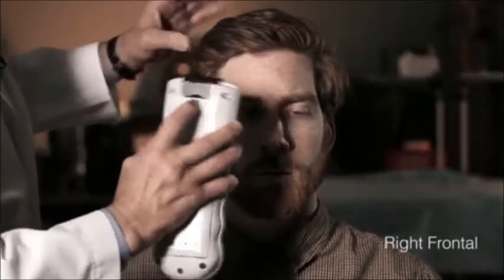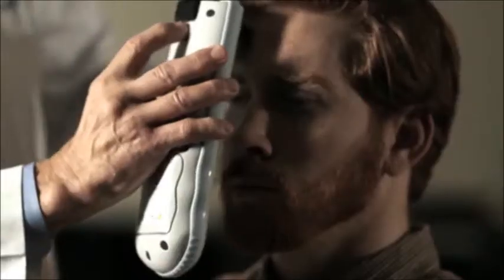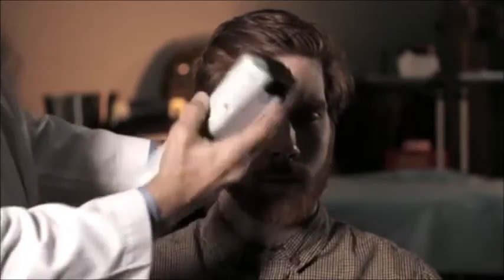And now we're going to go to the opposite side, and we're going to select a symmetrical point, again, mid-pupillary line between the hairline, above the frontal sinuses, firm but not hard pressure. We hear a beep, and we now have a symmetrical infrared reading showing green and green on each side, meaning that there is no hematoma at that level.